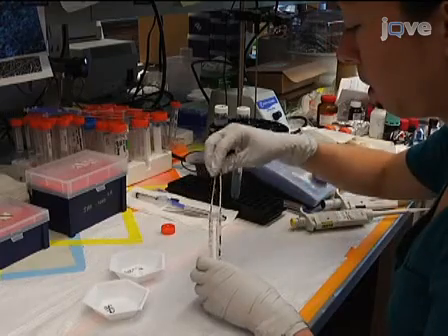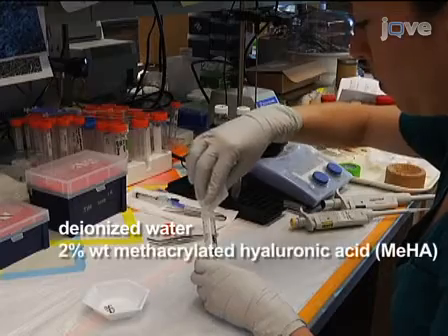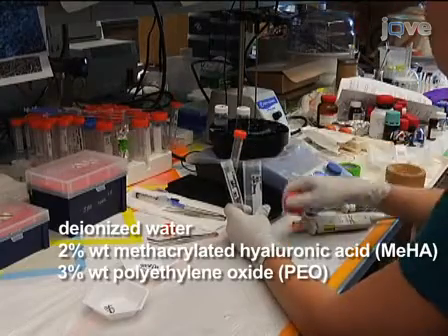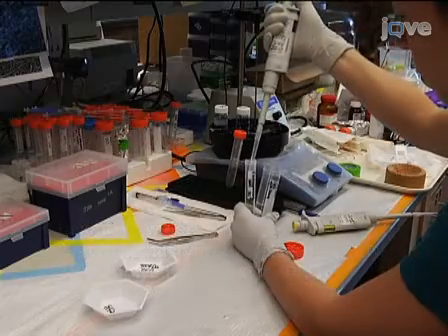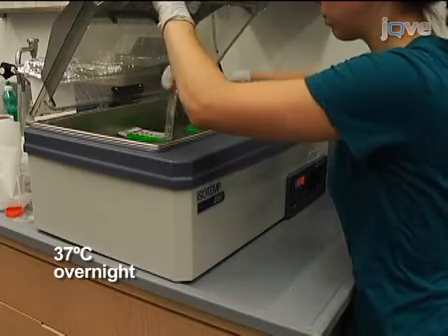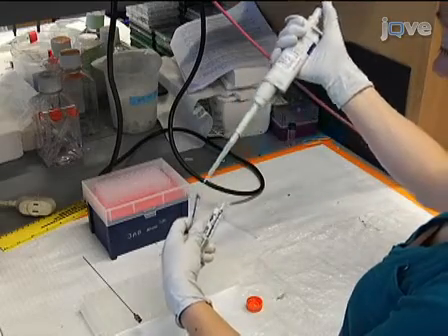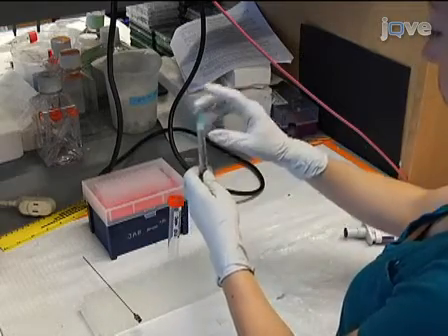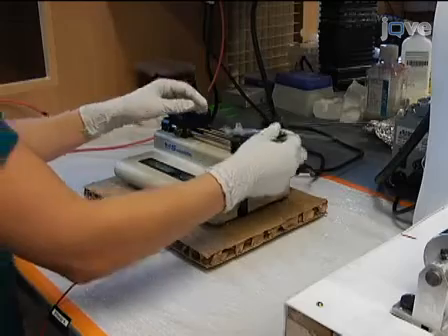To prepare the electrospinning solution, combine two final concentrations in deionized water: 2% weight methacrylated hyaluronic acid (MEHA), 3% weight polyethylene oxide (PEO), and 0.05% weight I-2959 solution. Vortex for 5 minutes and incubate at 37 degrees Celsius overnight to dissolve the solution. Transfer the solution into a syringe and attach an 18-gauge, 6-inch long, blunt-end needle. Next, use a syringe pump set to eject at a rate of 1.2 milliliters per hour, and insert the syringed needle into the syringe pump.